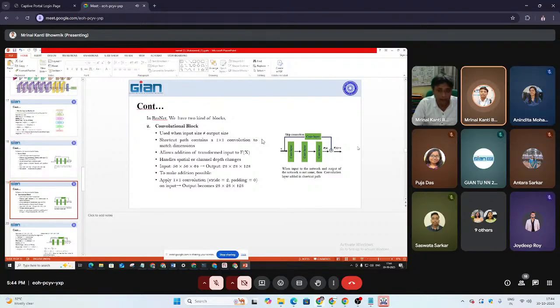Normally, a CNN architecture processes sequential layers by convolution, pooling, and so on. But in an attention-based CNN, spatial, channel or self-attention is included in the skip connection, or we can say wherever we want in the CNN to extract the features of that module. We can even extract multiple features, which sometimes get decreased during normal sequential CNN layers. The goal is to dynamically assign higher weights to get the most information from the pixel channels of the regions.